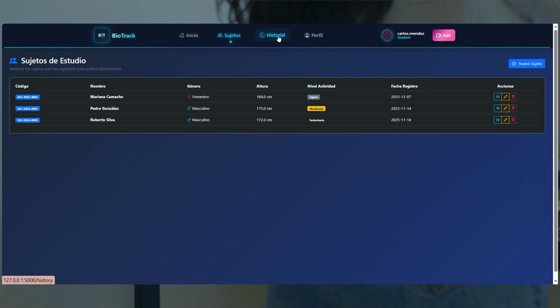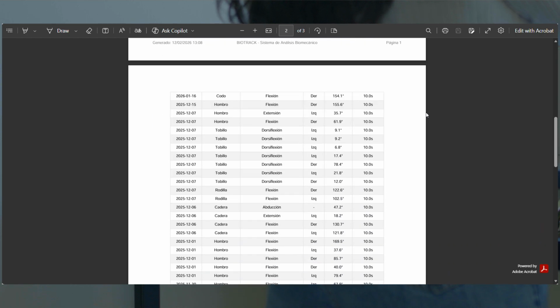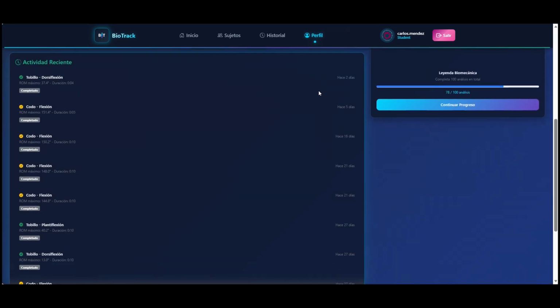Not a single value is taken; a stabilization window is applied. A smoothing by moving average is calculated over the series of interest: minimum, maximum, and functional range. Finally, that information is contrasted with the normative range and automatically incorporated into the report.